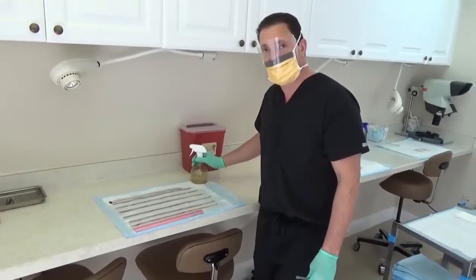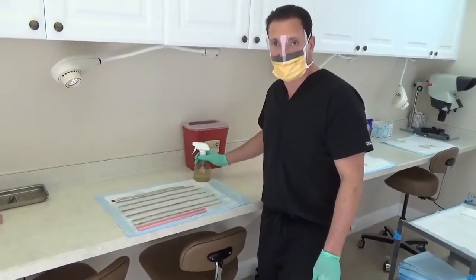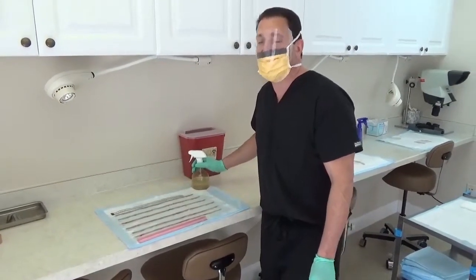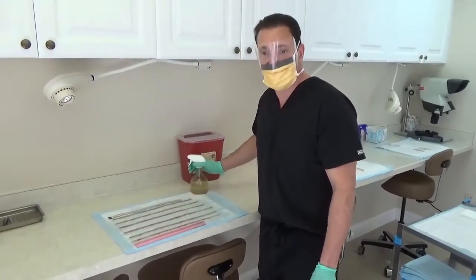Okay, and how long will it take your staff to dissect that tissue? About 2 hours, tops. Okay, and the placing is another 2.5 hours. So this whole procedure will be less than 6 hours from start to finish. 6 hours from start to finish for 15,000 hairs. Yes. Awesome.